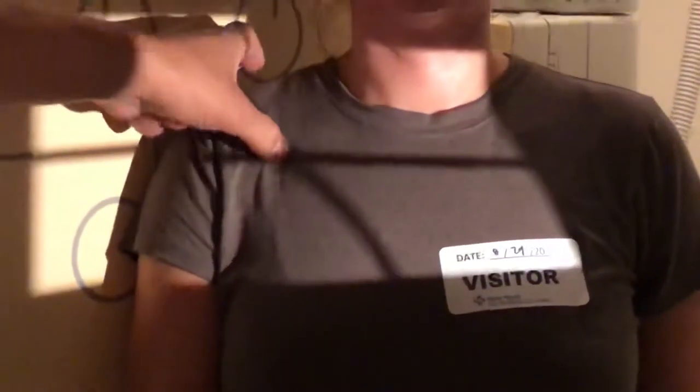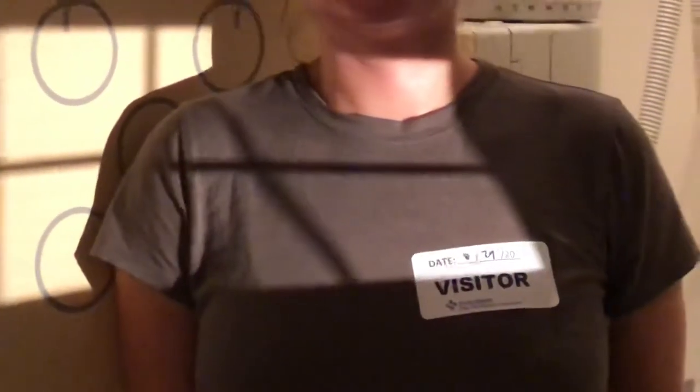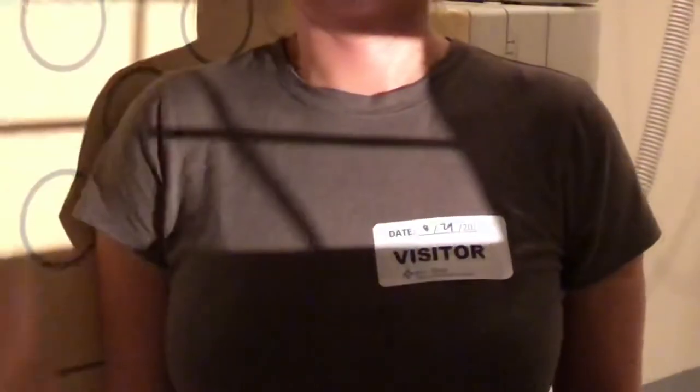The next one is gonna be a Grashey, and for the Grashey we angle the patient about 45 degrees towards us. We're gonna center right in this notch here — you can feel it — and we'll bring the arm down by its side and do an external rotation. The best way I figure out how to do this is I think of a football player getting ready to grab somebody or defend himself — they put their arms up like this, and this is the angle that you need.